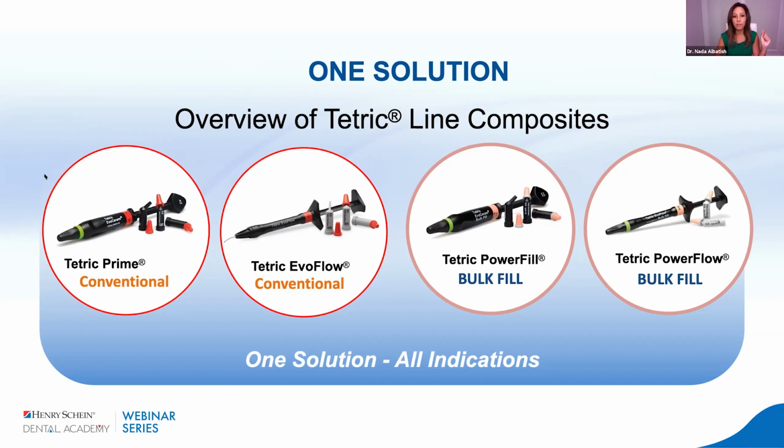These conventional composites, you can cure at 5-second cures. The bulk fill composites are incredible here because you can place increments up to 4 millimeters for both the flowable and the packable. Conventional also has a flowable and a packable here. So up to 4 millimeter increments, double the increment size, and you can cure them in 3 seconds. So imagine how efficient this could be on your posterior teeth.